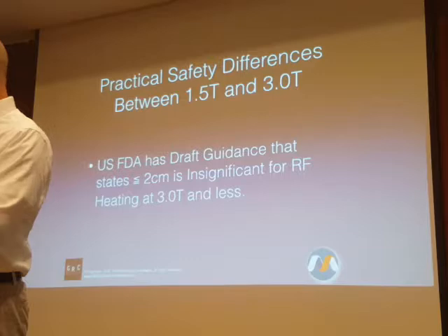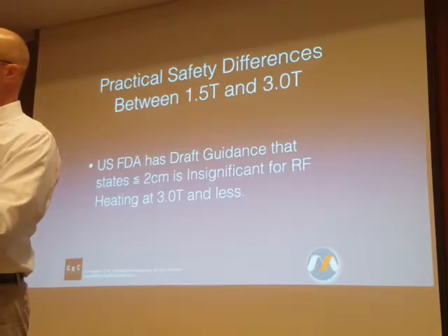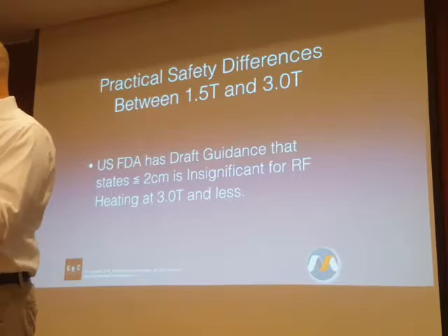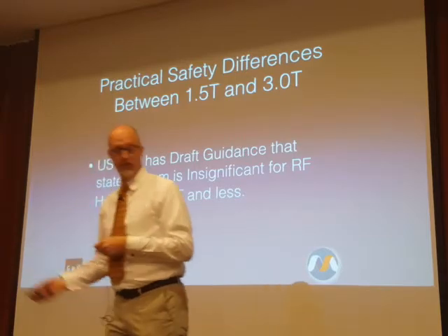So when something is partially in the body and partially out of the body, now the same object can experience resonant circuit heating at 2 very different lengths. And so it gets very complicated very quickly for things that are both inside and outside the body simultaneously.